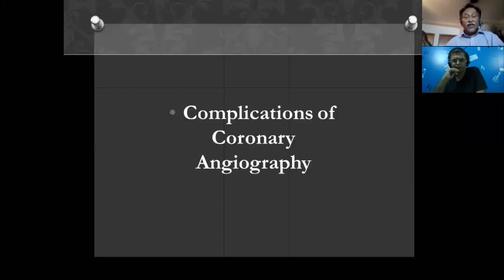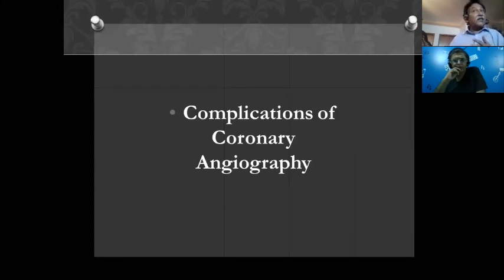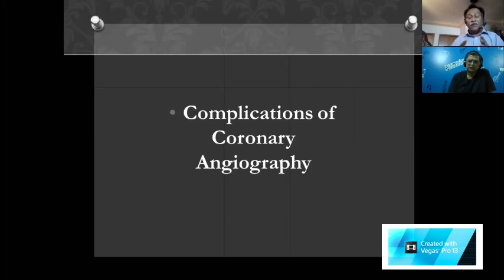Now a little bit about the complication of the angiogram. It is important. It is not like taking 2 cc blood and testing it, and if the report is not helpful, taking another 2 cc. Not like that. That's why the angiogram is a test that needs the patient to be within the hospital. It is something like a minor type of surgical procedure, with preparation of the patient, and you need all possible measures to tackle the complication. So you must know the complication so that you can manage it properly in time.